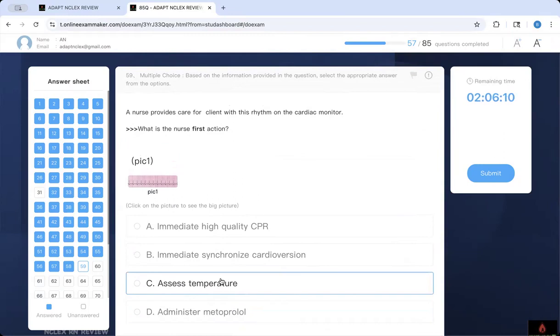If you have EKG issues, this is the clinical application of EKG. We are not just reading EKG, but I'm showing you how you can read the EKG and apply it. That's how the NCLEX will ask you. You can identify the EKG, but you don't know what to do. Therefore, pay attention and write some keywords.